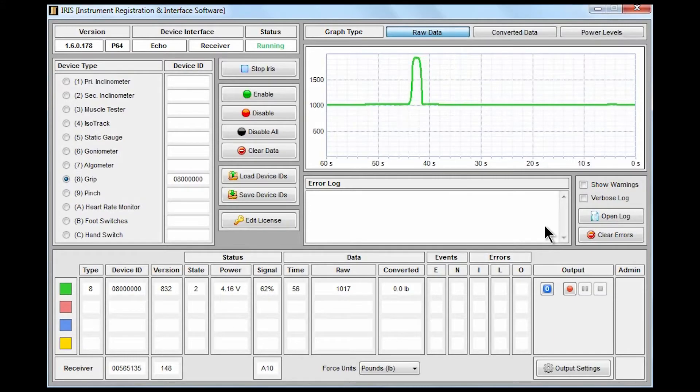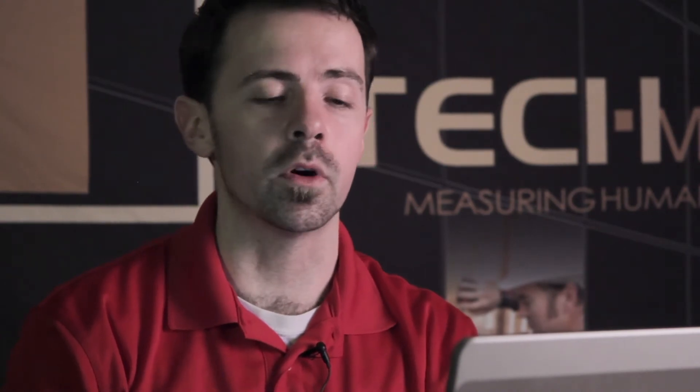So that could include two inclinometers for dual inclinometry, range of motion and strength concurrently if you wish. Basically any of the devices on that left hand side can be connected simultaneously, up to four at a time.